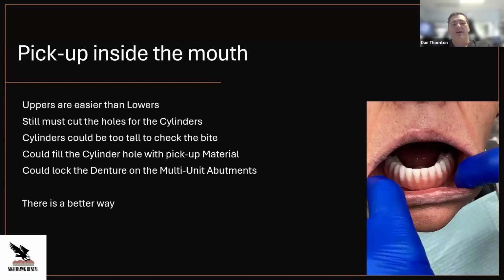Now, when you're doing the pickup in the mouth, there's some interesting, fun ways to do it. Like I kind of went over it between making the cylinders fit and everything else. Is the multi-unit in the correct location? Actually, I'm getting a little bit ahead of my slides. It's funner when you can actually do this. The stackable guides are easier to do. Sometimes you kind of feel like you're just filling the holes unless there's an issue. And then you've got to think, how do I get this to work? And over time, you kind of pick that up.